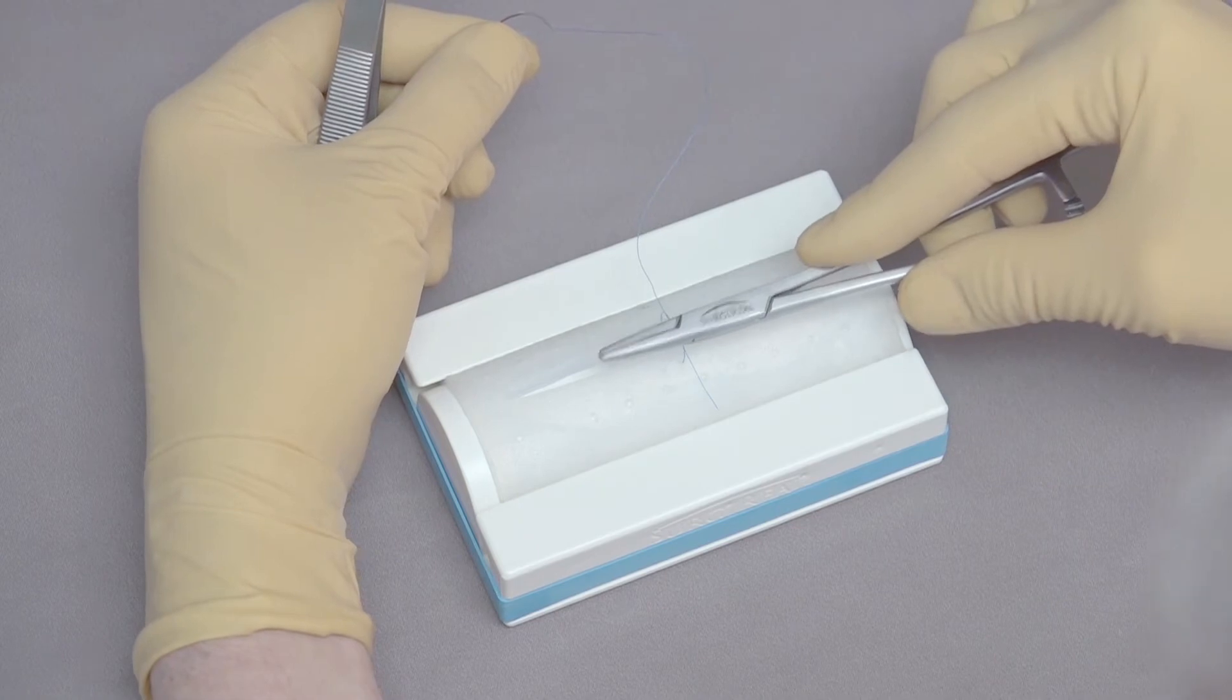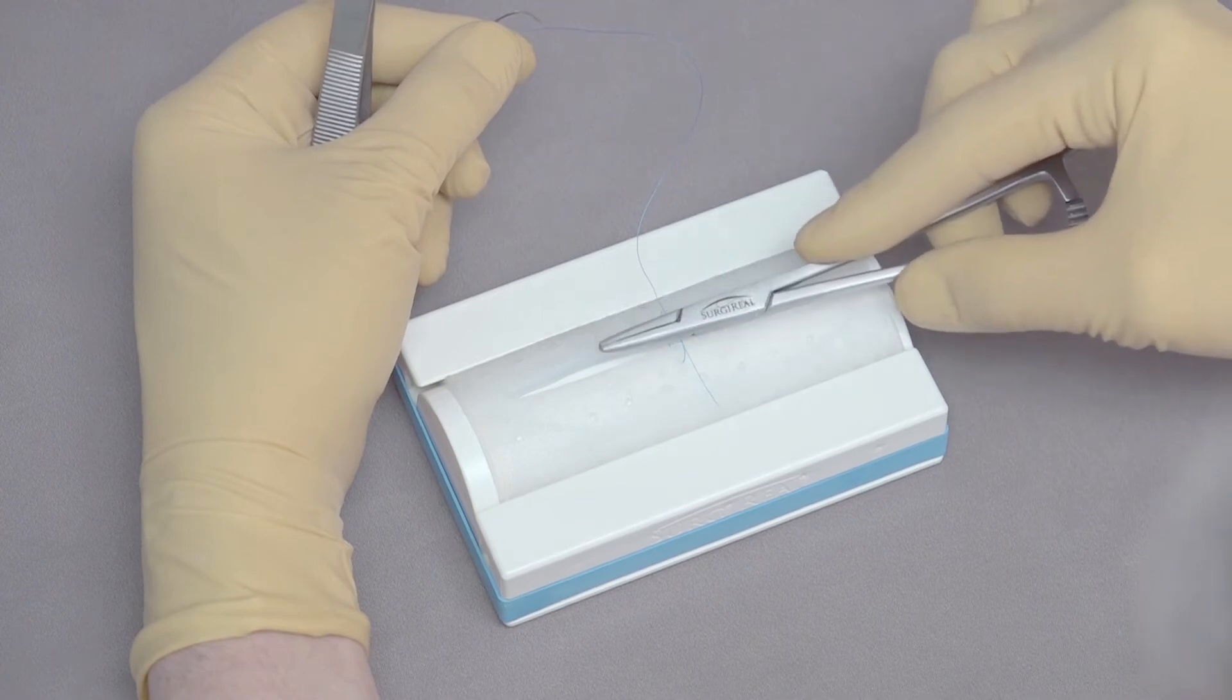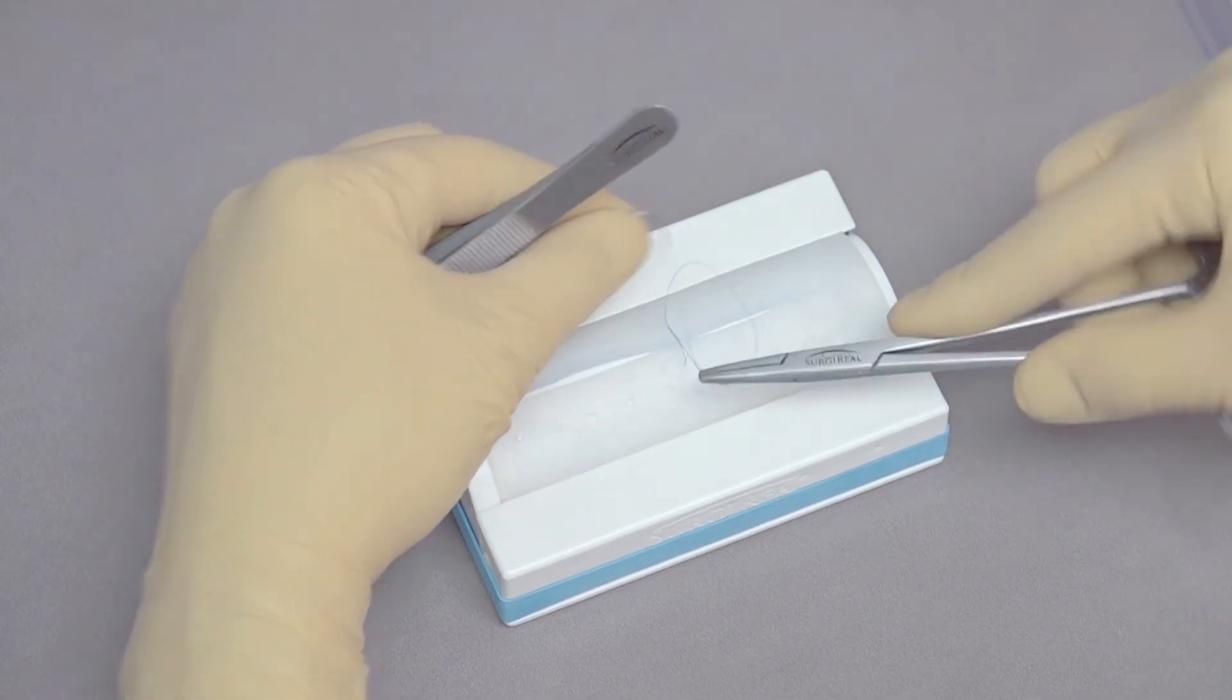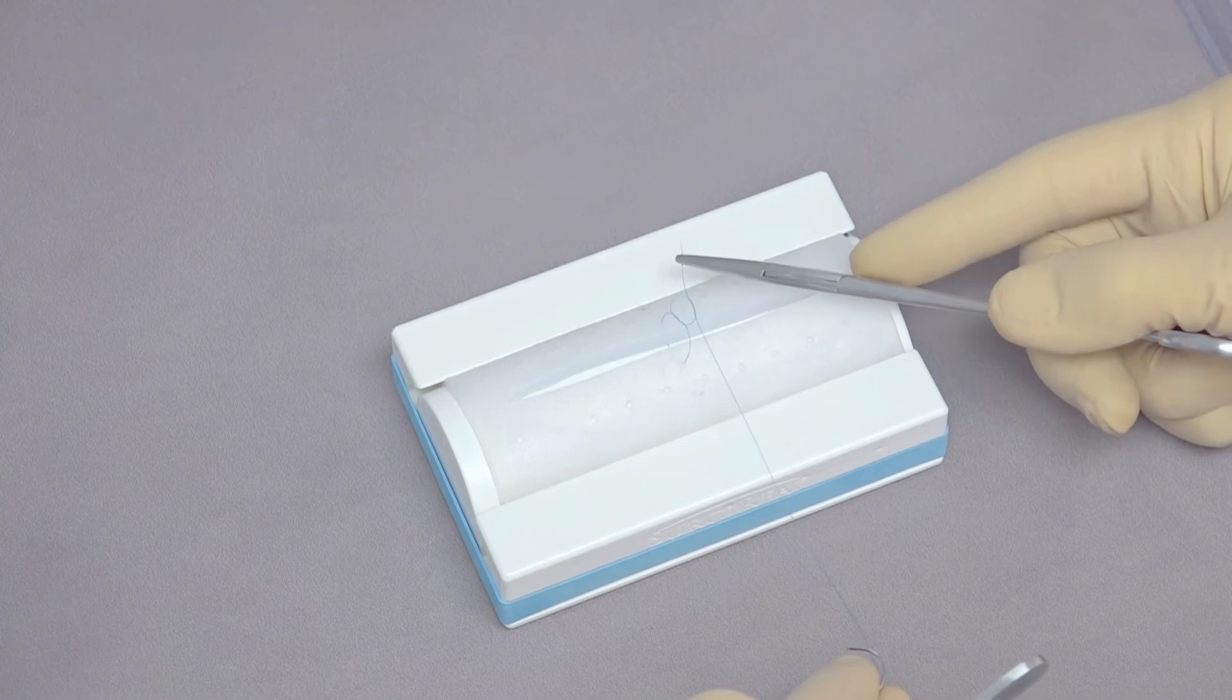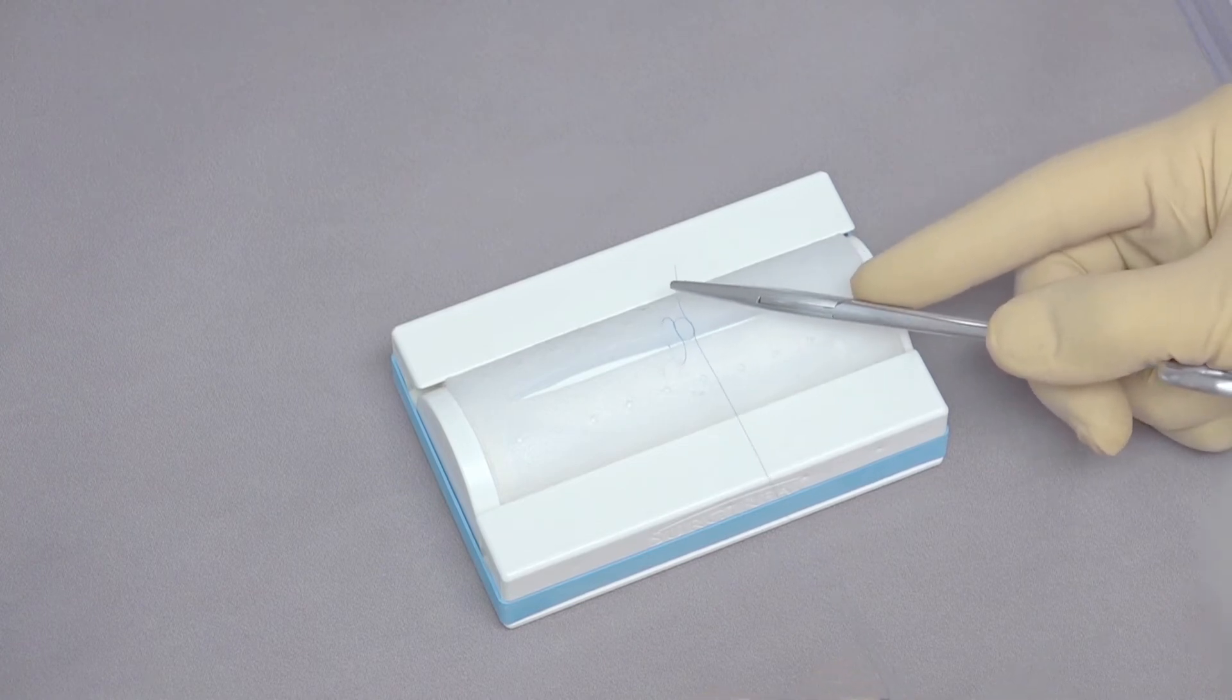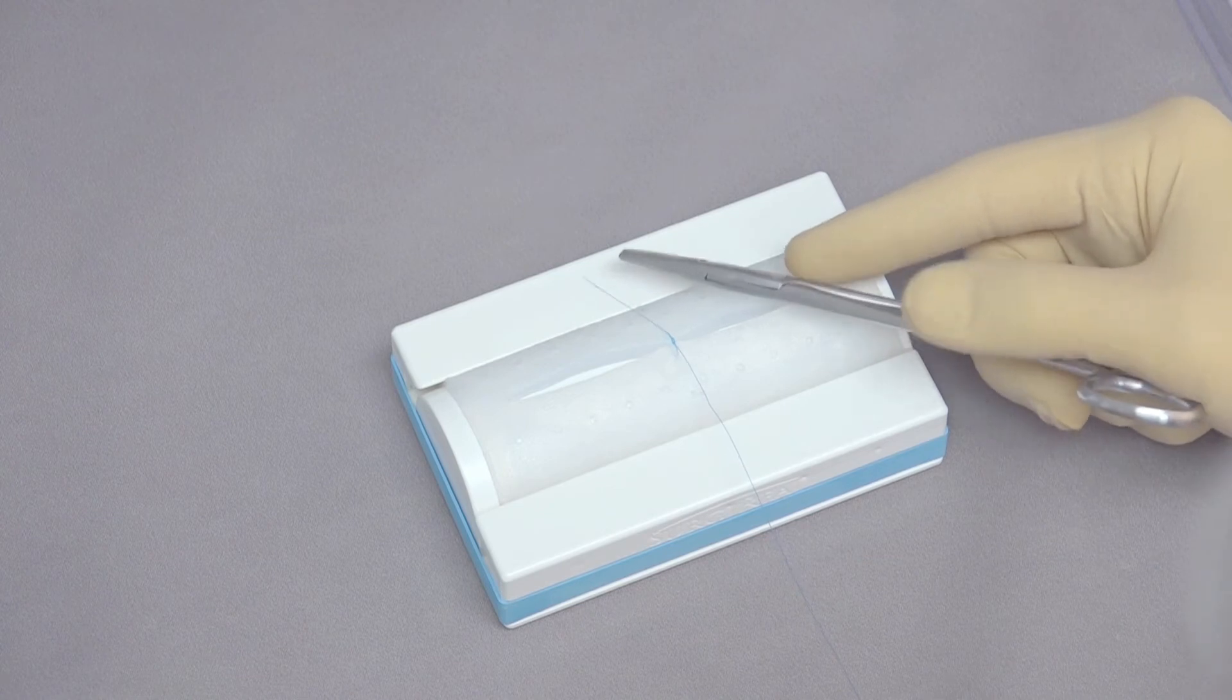Needle holders in the middle, not on the side. If the needle holders are here or over here, it will be a granny knot, so we want to put them right in the middle, come around the needle holder one time, grab the suture, rotate the needle holders over, and this is very important to pull evenly. If I pull unevenly with one end or the other, it can form a slip knot. So in this case, I want to form nice even sutures, tensioning down until I oppose the skin, and you can see how that knot will slip.